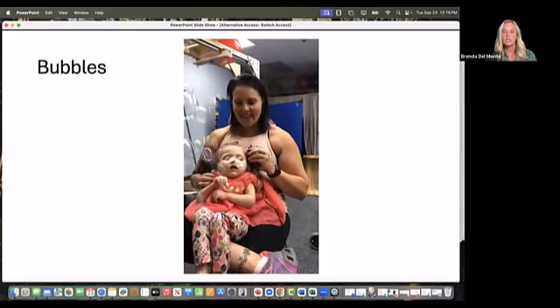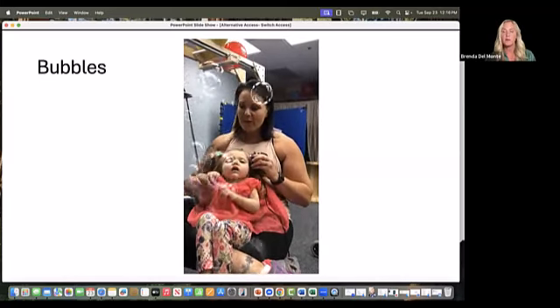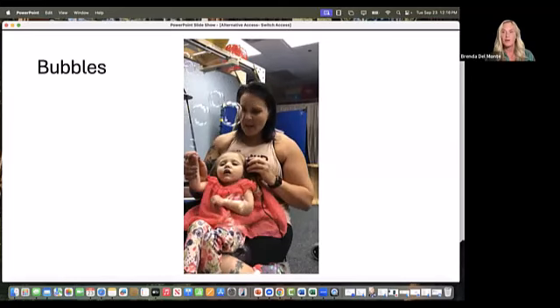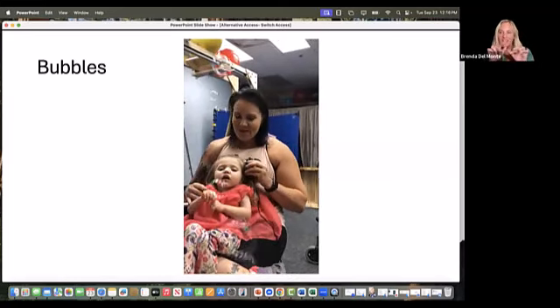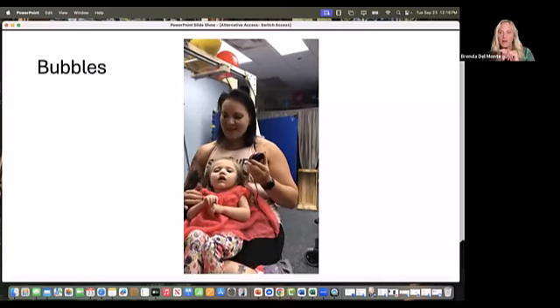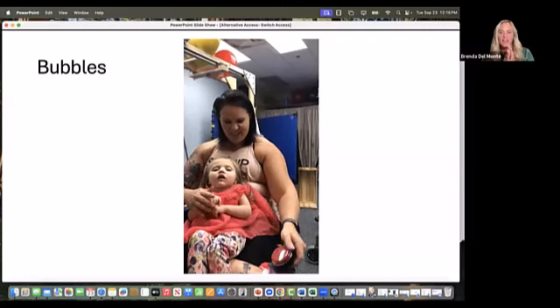She's going to get consistent with how far away that switch is so that a motor plan can be built. We mostly think about motor plans when we come to the QWERTY keyboard with ASDF and all that kind of thing. But every plan, she ended up being an eye gaze user. Your eyes are still in a motor plan.